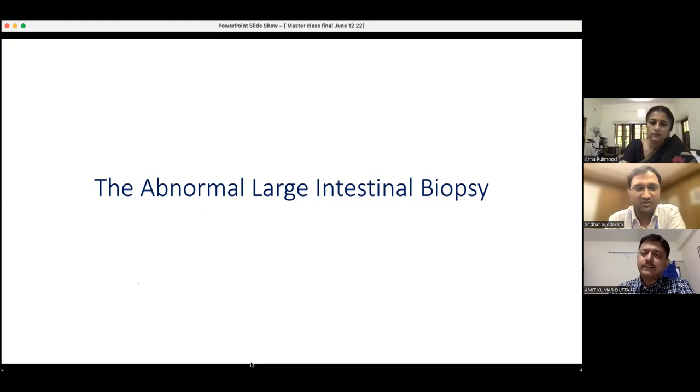Okay. In terms of the colon, between the right and left colon, are there any glaring differences when you look at histology? In the cecum and ascending colon, you might get more eosinophils than in the left. The other thing is the thickness of the muscularis mucosa, but that's not really very significant in any pathology. So the important thing, I think, is just the inflammatory content.